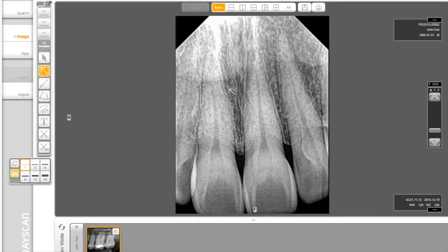Finally, you can put an arrow and draw a line in the image under Annotation. If you would like to change the thickness and color of the line, click the option as shown. Also, you can do polyline and free drawing. And you can put in some text.